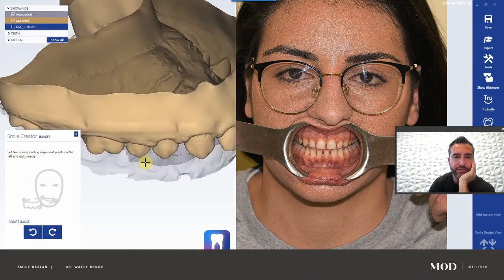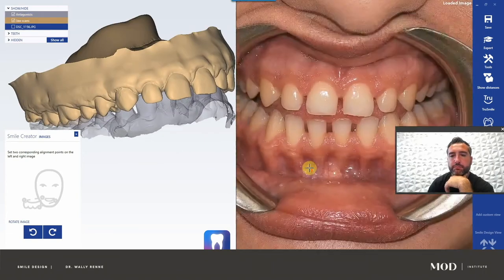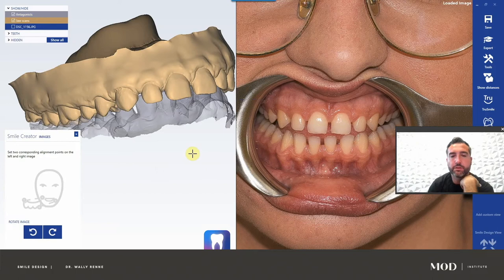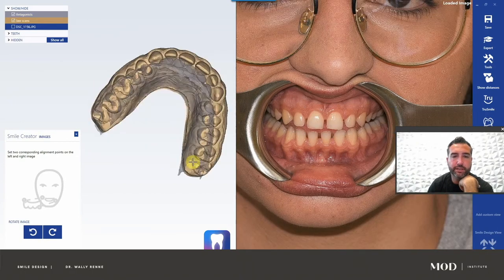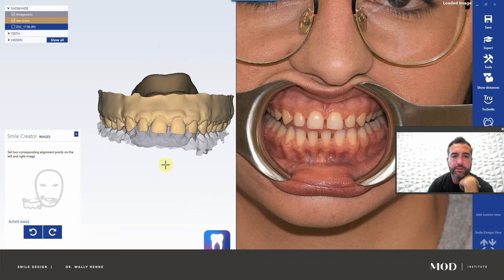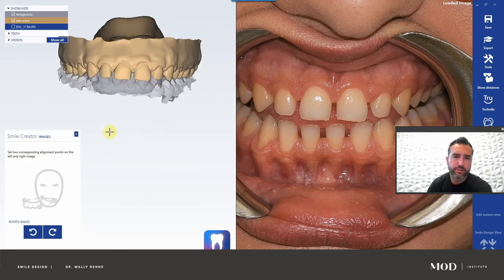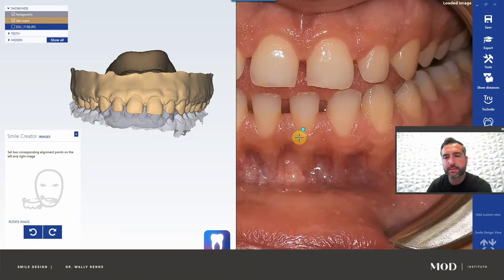Now we have to pin this 3-dimensional object to this 2-dimensional photograph. The scroll wheel zooms in and out. Right-clicking out here rotates the model. Left click is what's going to put points on the teeth. To translate, you click both mouse buttons at the same exact time — that's actually the most annoying part. If you accidentally drop a ball, just click the ball and move it. Clicking both mouse buttons is supposed to translate the model, but it tends to drop balls.